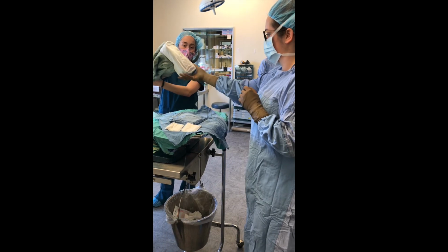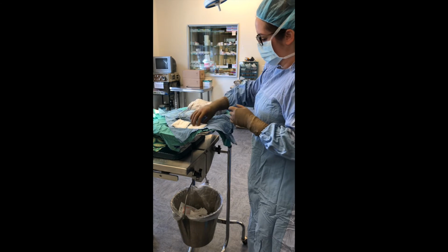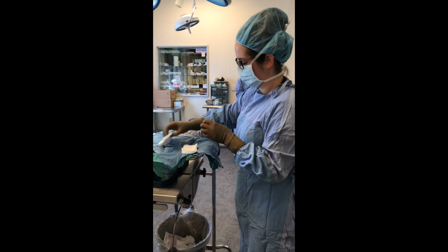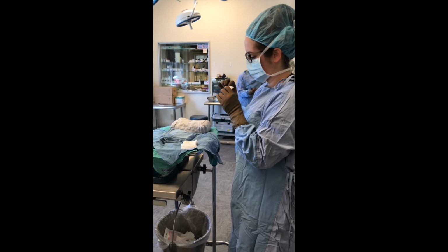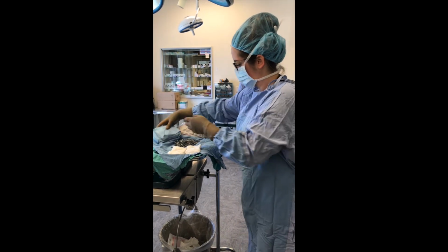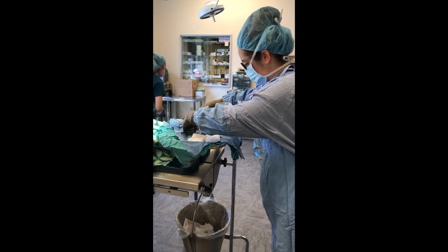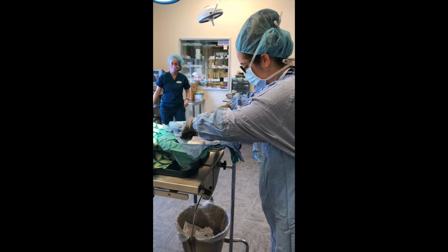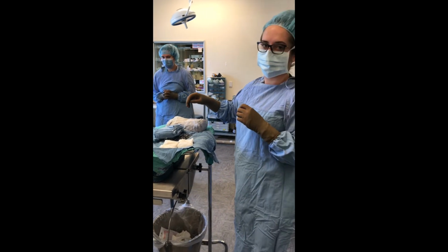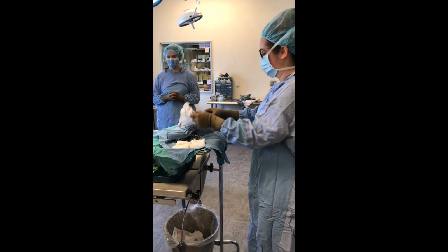Just grab that. This is strange. We have 15 gauze. As we should. Perfect. And 12 instruments. So we'll recount at the end of surgery to make sure nothing's left in us.